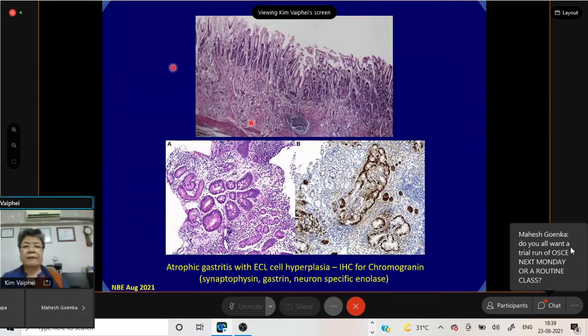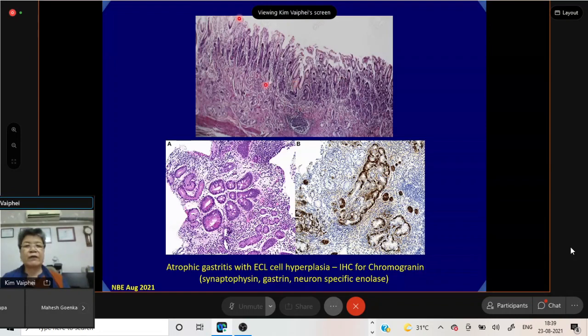And this is another atrophic mucosa. It looks very, very cellular here. But in addition to that, there are large areas of fibrosis. The big cluster of lymphoid tissue, then there are large clusters of some glands in this low power, along with a lot of disorganization of the surface mucosa, that is, the foveolae.